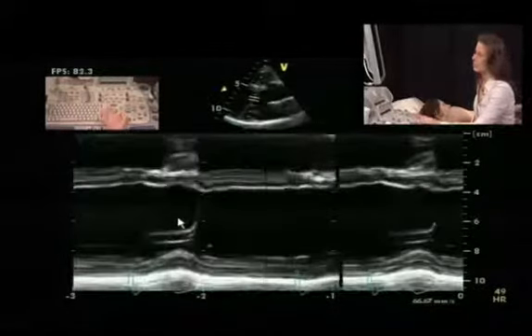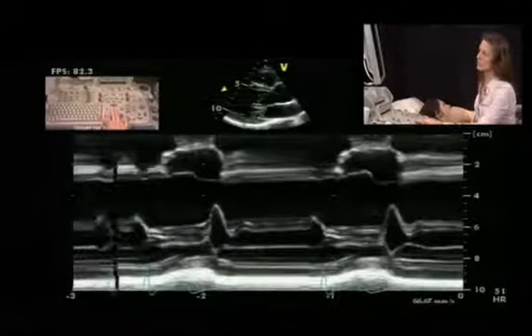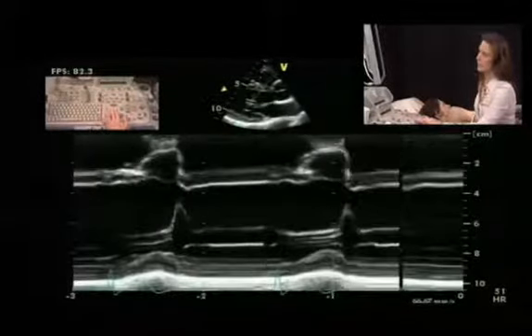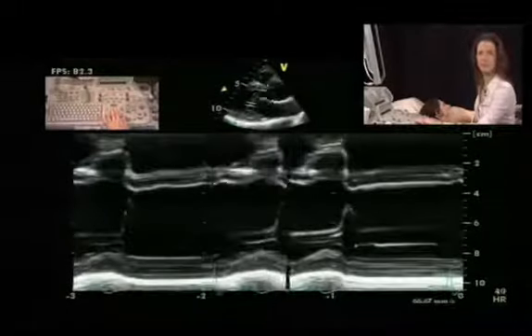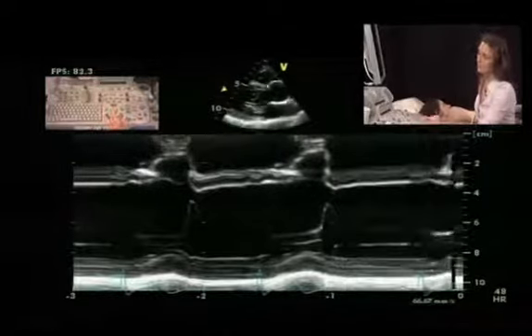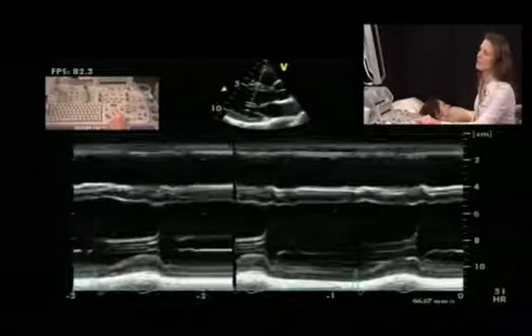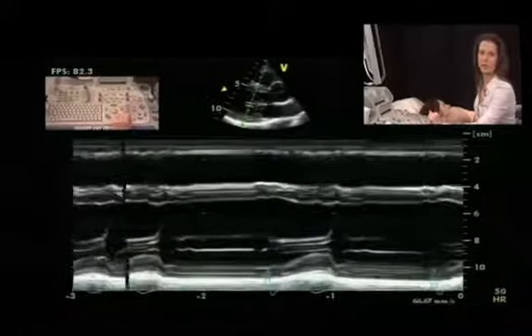You can change this line by just taking the trackball. You change the position, you have the small sample volume in the middle. This is to angulate, to define the angle. Just press the enter button, and then you can change it and make a real proper acquisition now.